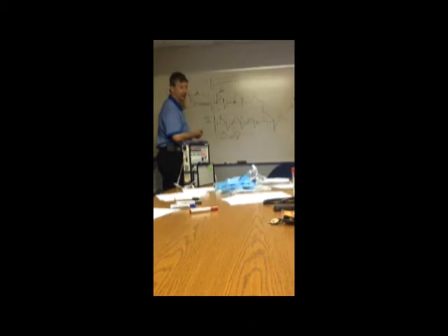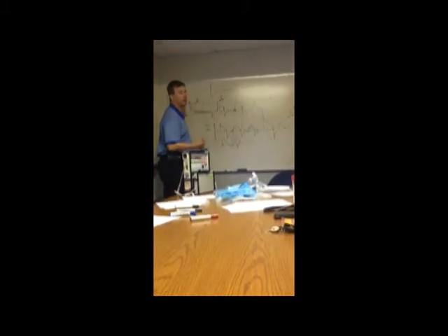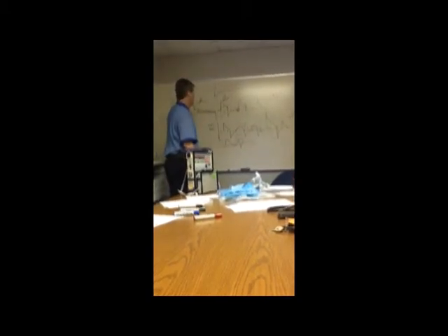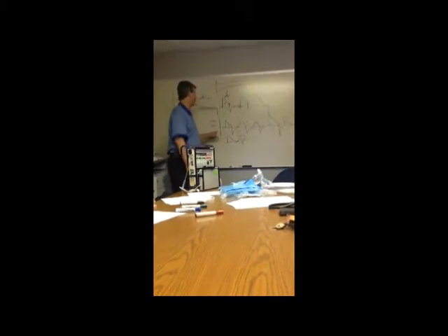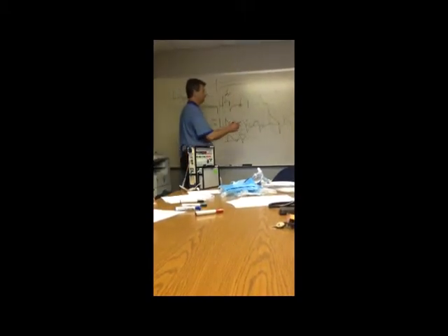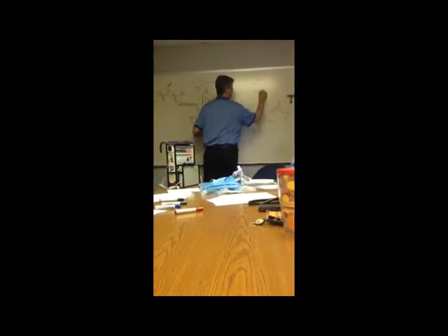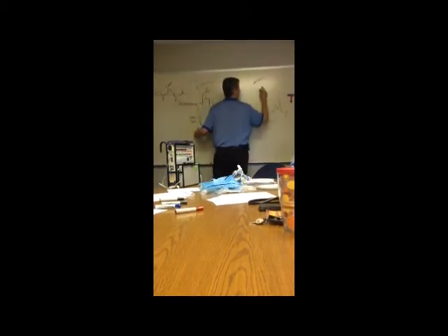So I would switch. I'd say, thank you for letting me have this patient. The minute y'all leave, change it out of CPAP PSV. It was not a safe mode to transport. They're going to work and work and work until something bad happens. So I would transport them in this if they're comfortable. If they're not comfortable in SIMV, volume, switch them to assist control, PC if you have to.